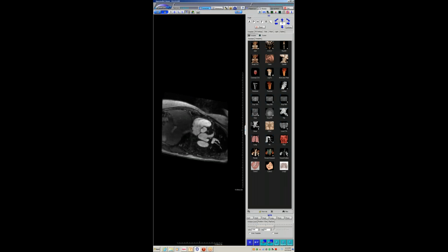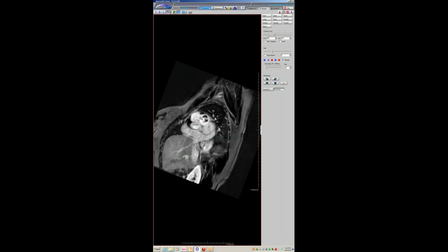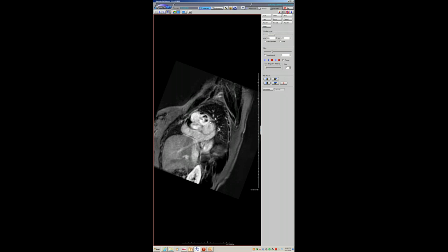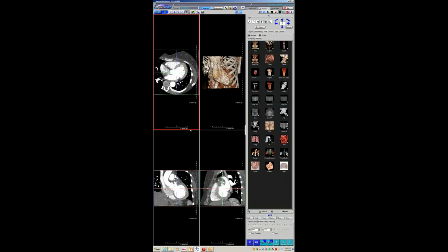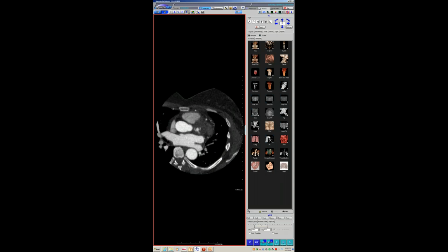Again, there's the bicuspid valve. And then the other interesting thing, if I go back to this study very quickly, is that she also had delayed enhancement here, but then there's this infarct here. So I was looking, and I was like, that's not a left atrial thrombus. That's a big pseudoaneurysm. I would get a CT just to assess that, and also assess the coronaries, because the thing was quite big.